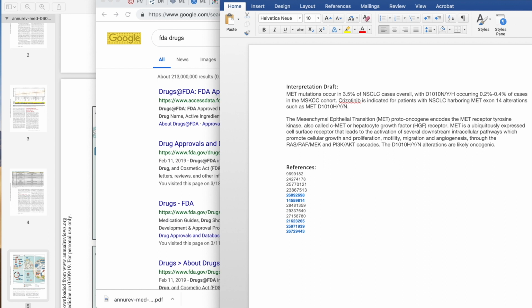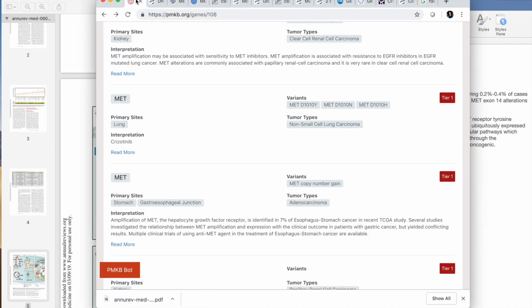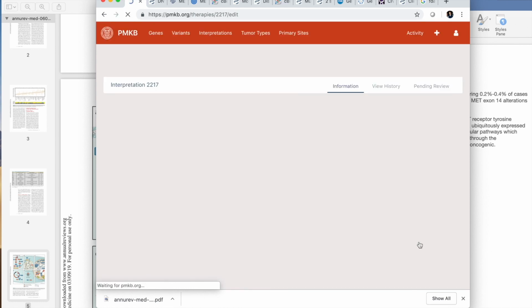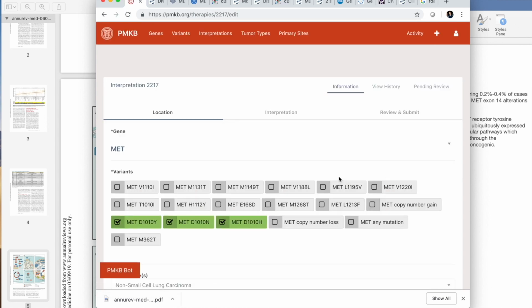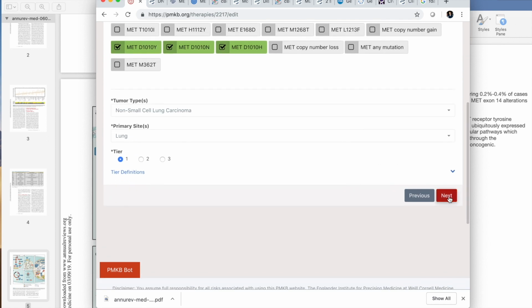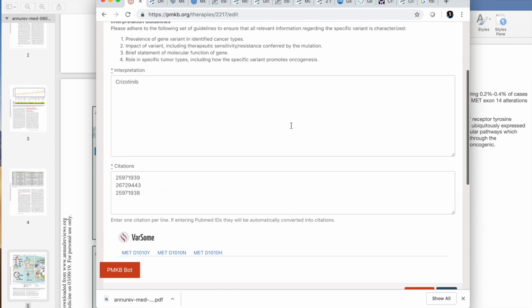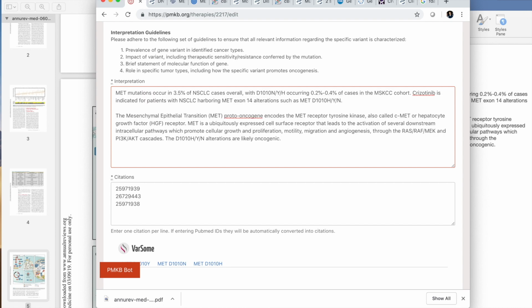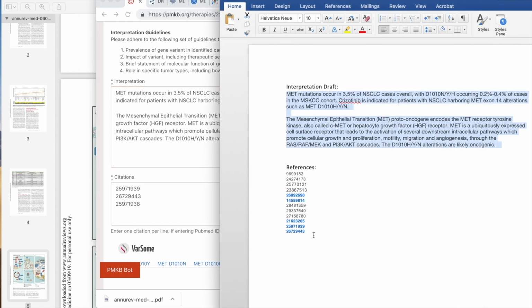Okay, and now we can post this on the PMKB website. Let's copy this, and we'll go to our interp. Let's click Edit, and let's scroll down. All right, and we'll add our references.